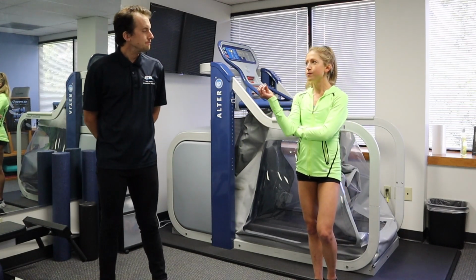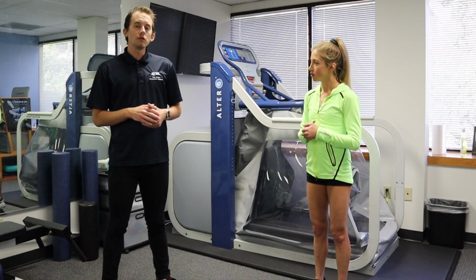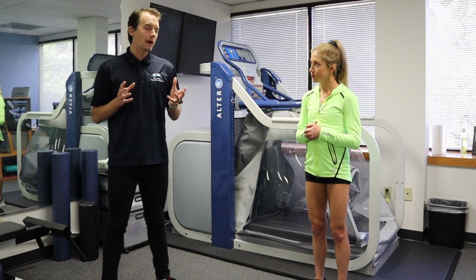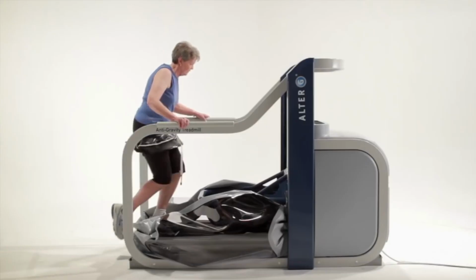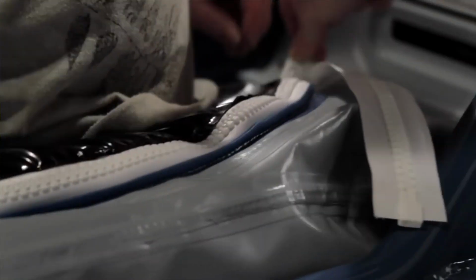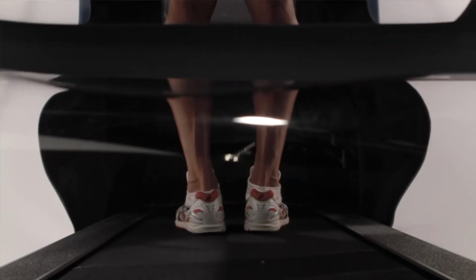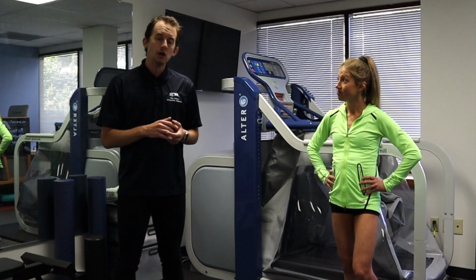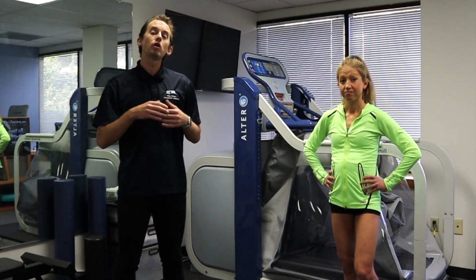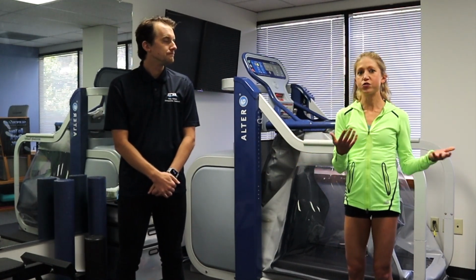So how exactly does that help somebody with a bone injury, a stress fracture, run? Great question. So the AlterG has a lot of different uses. In the injury prevention realm, we find it most valuable for bone-related injuries like stress fractures, full fractures, just because bone recovers quicker with a little bit of impact, but not someone's body weight. So by getting a controlled, increased amount of impact over time, the bone will come back stronger. It's Wolff's Law.